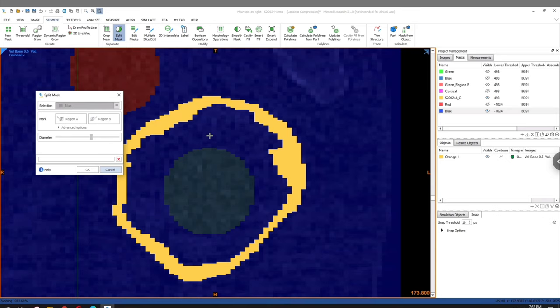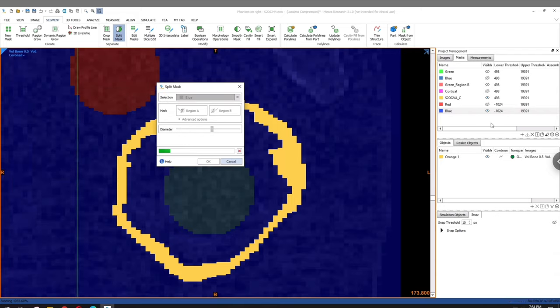Now, unfortunately, due to the limitations of distinguishing between trabecular bone and bone marrow, we're going to be treating everything inside of our cortical shell as one material. And when we're performing our finite element analysis, we're just going to be using those same conditions and that same linear approximation of bone density to Young's modulus, as is indicated in the literature, regardless of whether the material we're working with is bone marrow or trabecular bone.